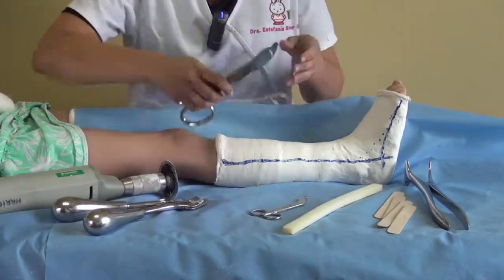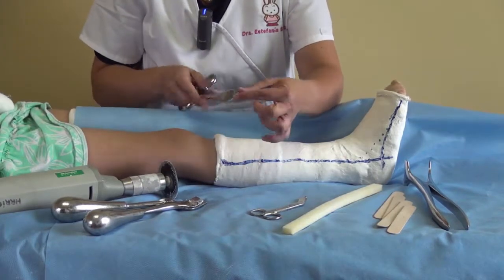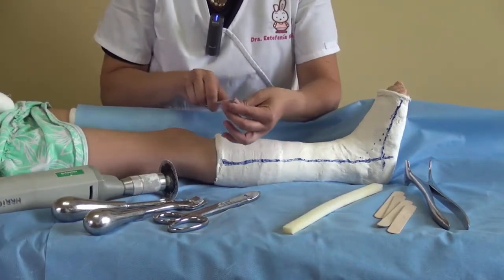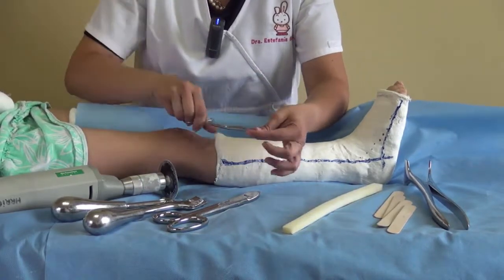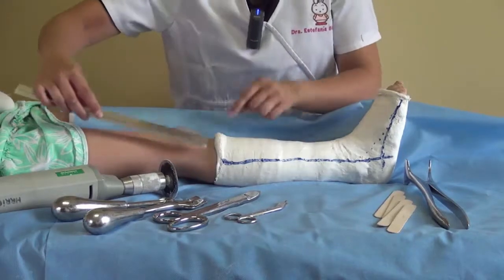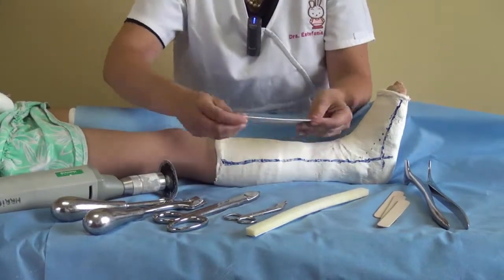You can also use scissors — special scissors for cast with some teeth and also well protected so as not to damage the skin. For the padding, the cotton or whatever you use to pad the cast, these are special scissors too, with the protection and the point. To cut the cast and protect the skin, you use this kind of splint or maybe this tongue depressor if you don't have any special tool.